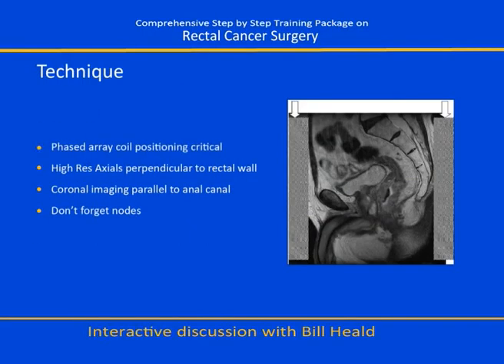I'm sure from an operative point of view, it's also the point when we evert the specimen, particularly with anterior tumours, where we're most likely to rupture the specimen. Exactly so, yes. There's no sphincter wrap at the front, there's just that interface with the prostate. Yes. So when we're reporting these scans, it's very important, therefore, to relate where the invasive edge of the tumour is in relation to the top of the puborectalis sling, as well as obviously what we also give, which is the height of the tumour from the anal verge.